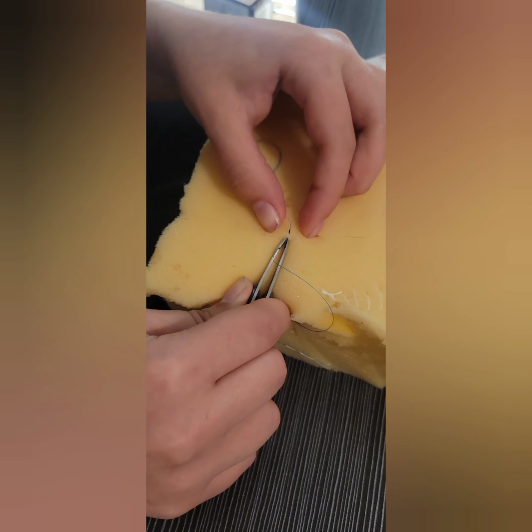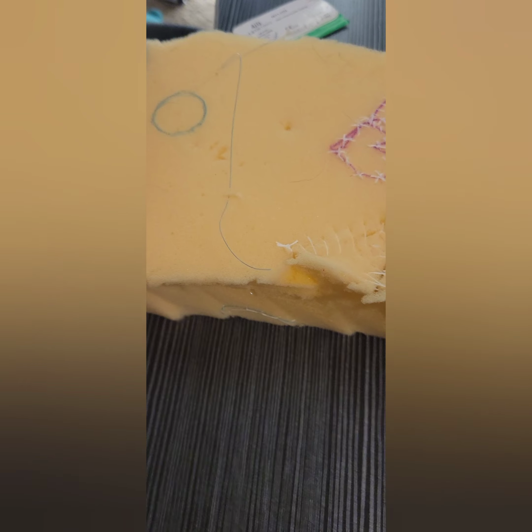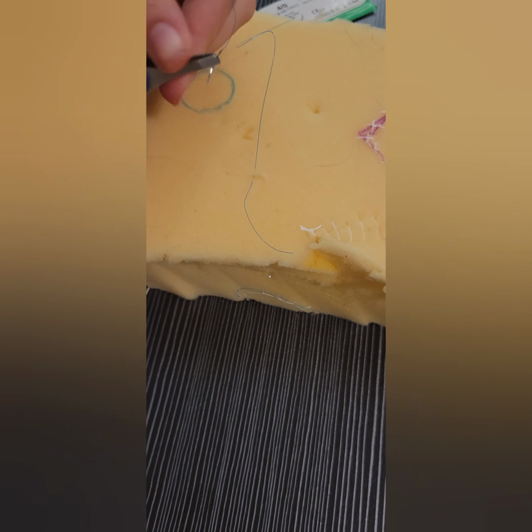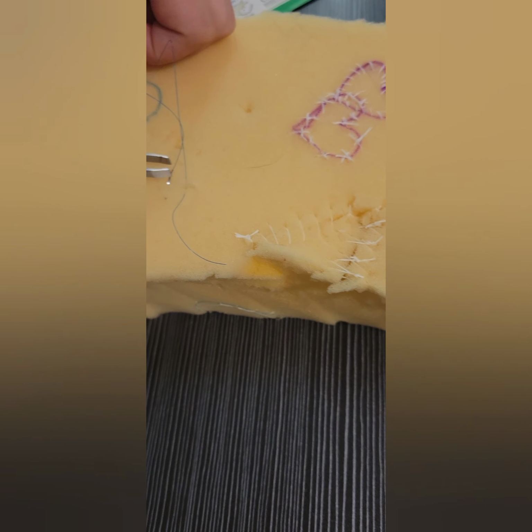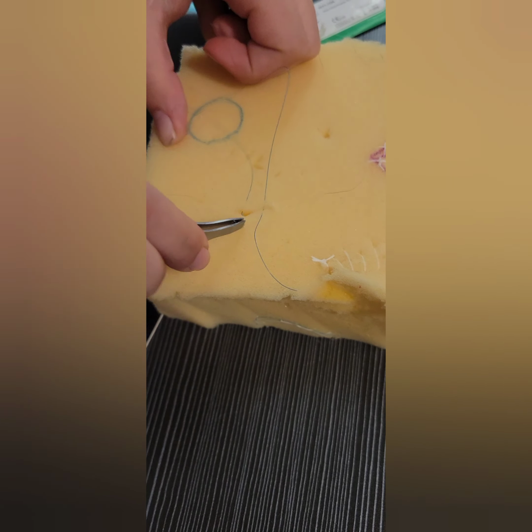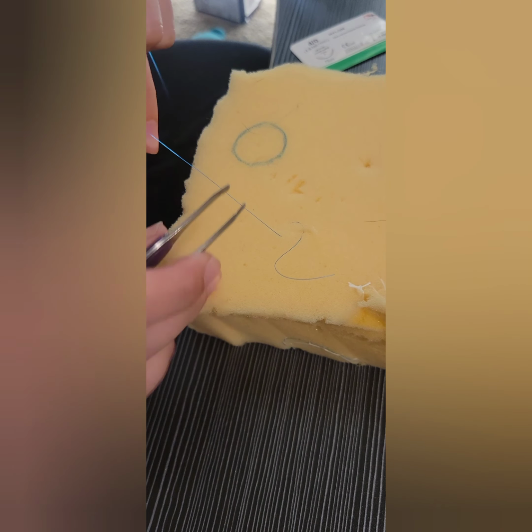Okay, the last stitch that I'll be showing you how to do is a horizontal mattress stitch. This is one of the last suture patterns we learned. So you go through right to left, and then you come back through, so you're kind of making an oval shape. Once you get that through the skin, you tie the 2 together. And this is underneath the skin, so you will only see the 2 sides of it.